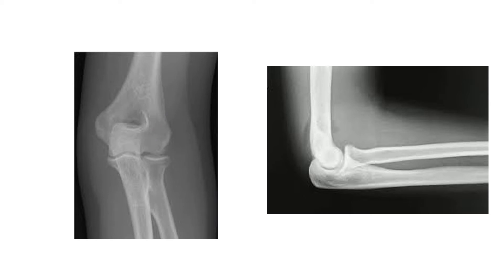So in this joint we can identify the trochlea, the capitulum, the head of the radius, and the coronoid process as the articular surfaces of this joint. The rest of these portions are non-articular surfaces or parts.